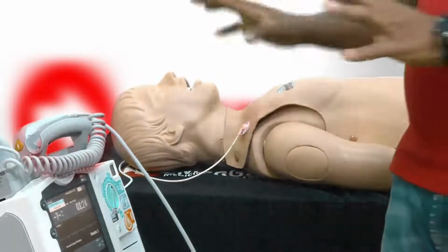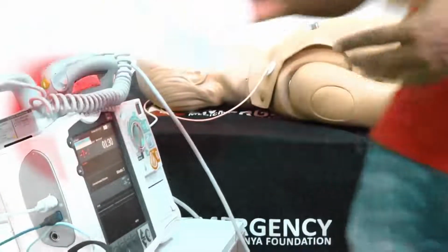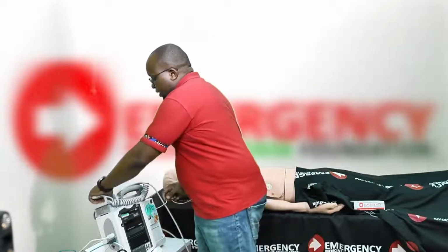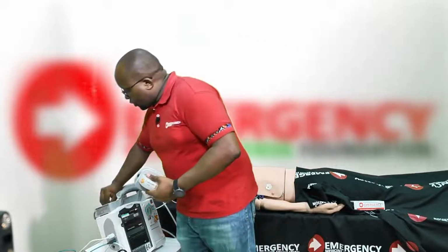So that's very simple. Using paddles, you quickly check the patient's rhythm and shock the patient if indicated with ventricular fibrillation. When you're using paddles, there are normally some lights here. So if you noted, the two things I did.